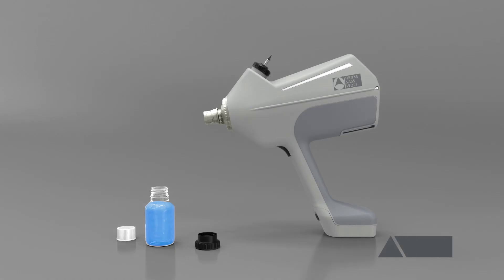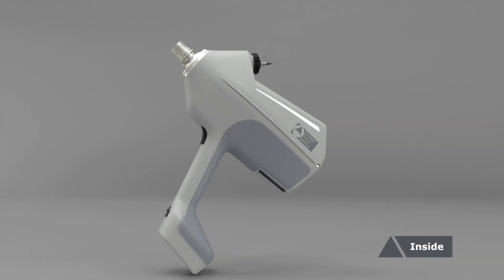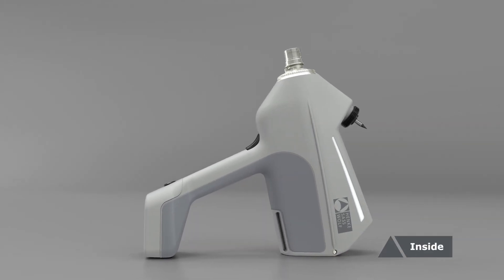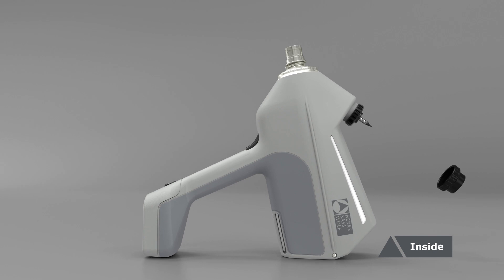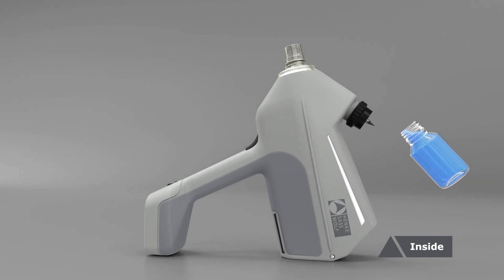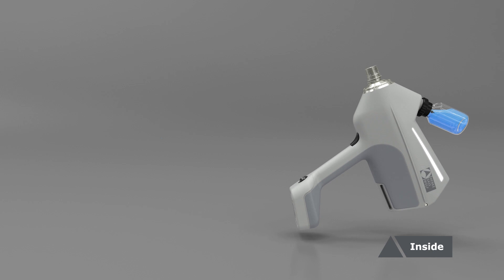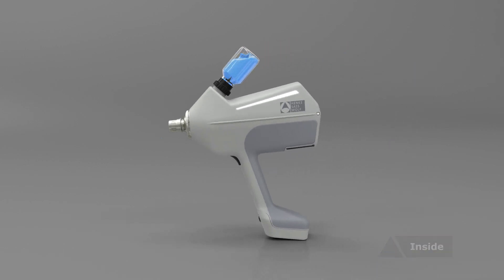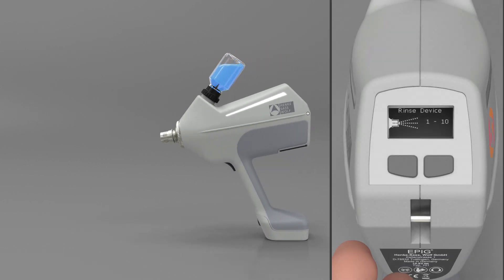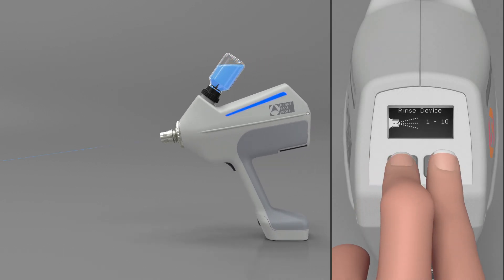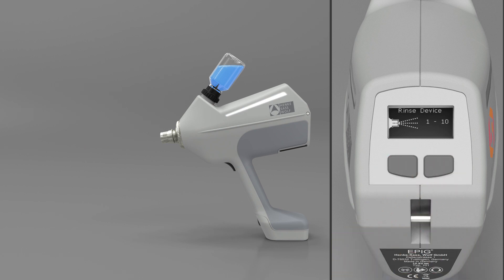To clean your device from the inside, connect the 100 milliliter PET bottle filled with the predefined cleaning fluid to the device. Start the integrated rinsing program by pressing the two display buttons simultaneously for three seconds. The device will rinse itself 10 times automatically.